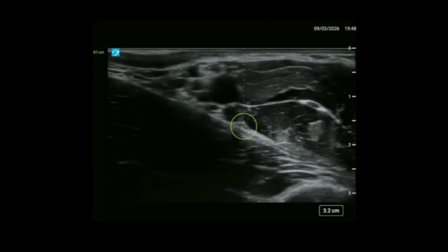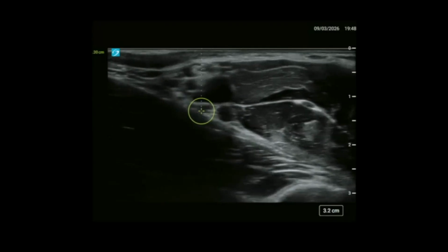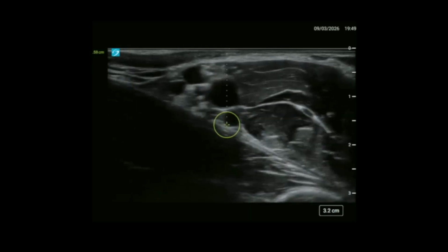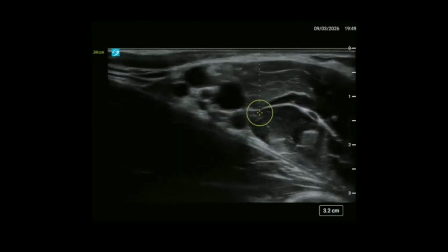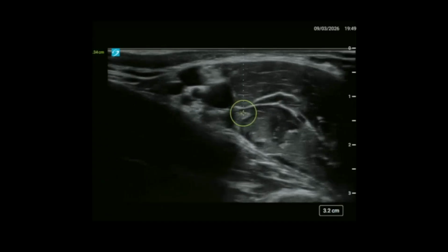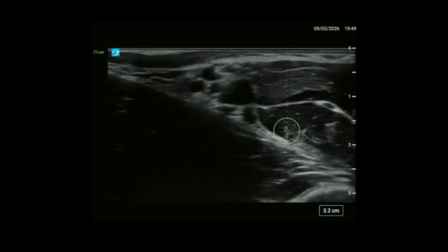And then we can use the conjoint tendon to funnel local anaesthetic for us, and funnel it proximally up into the axilla. And that will then enable us to open up a space for us to then move our needle, usually underneath this vessel, and then to get around the radial nerve. You can also sometimes come between these two structures, depending on where they are, but it is a bit of a high risk strategy, because you could go intravascular.